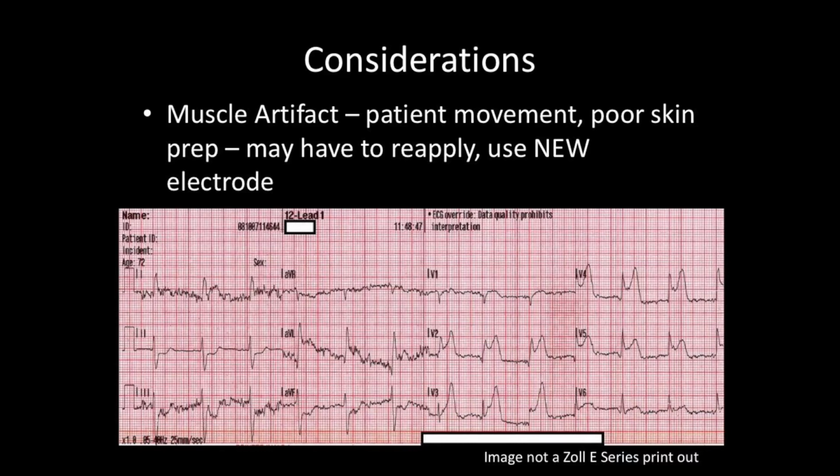Okay. Now, do you see this? What does this tell you? That's not going to give you an accurate reading. The machine won't be able to interpret the picture that it took because of all the artifacts. This is the only thing you can get. It's the best you can do.